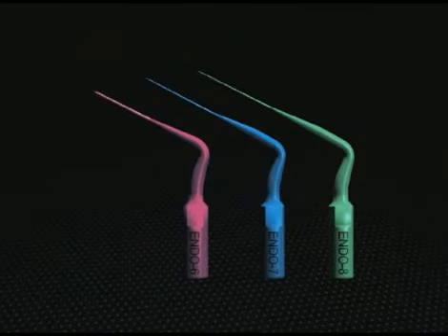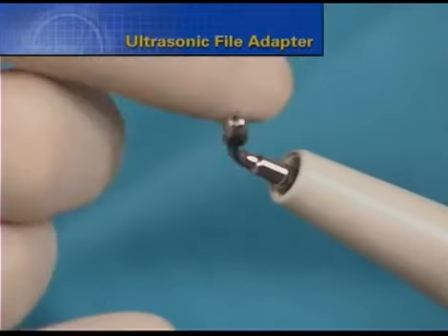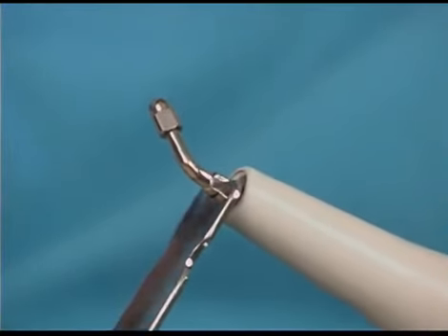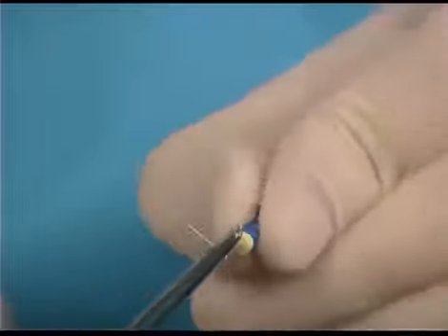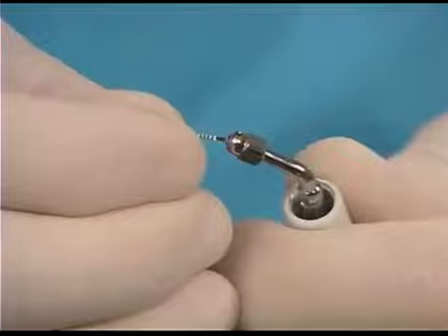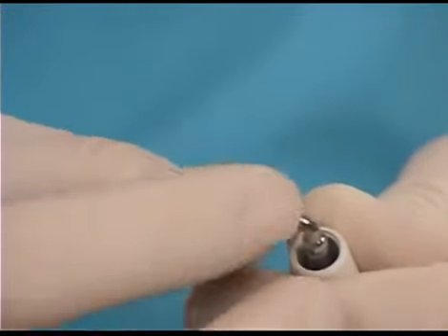Specifically, when excellent coronal and radicular access exists to an obstruction, ultrasonic trephining procedures will oftentimes loosen a broken instrument and jettison it from the canal. Sometimes ultrasonic trephining procedures are unsuccessful due to a lack of vision or anatomical restrictions. In these instances, the handle from a stainless steel hand file can be intentionally removed and the shaft of the instrument inserted into a device called the file adapter. The file adapter threads onto the ultrasonic handpiece and its chuck will retain an O2 tapered hand file.